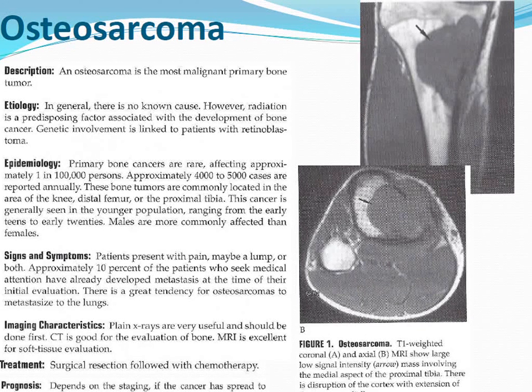But MRI is going to be really important for evaluating the extent in the soft tissues, what muscles are affected, what the surgeon has to work with in order to make this patient be able to walk after they get their treatment.